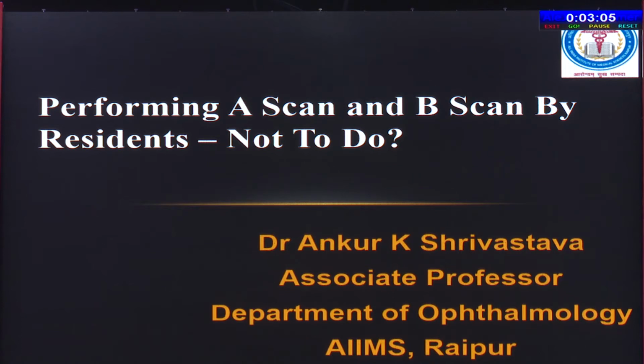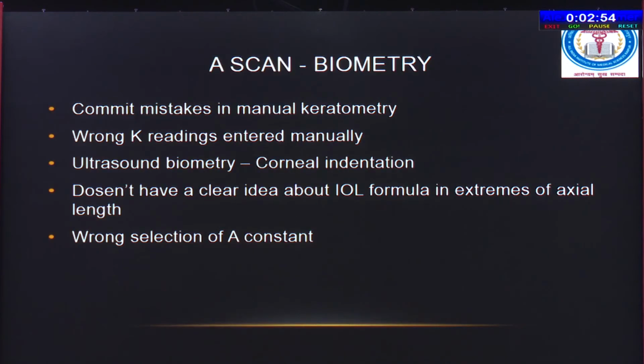What not to do, which surgeries you have to say no to. The final decision is what not to do. So that is what I'm going to talk about. My topic is performing A and B scan by residents, starting with the A scan biometry.